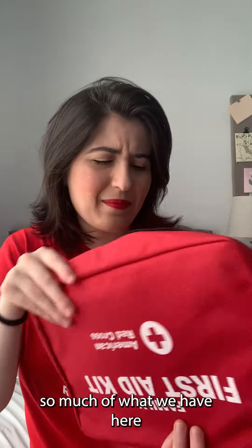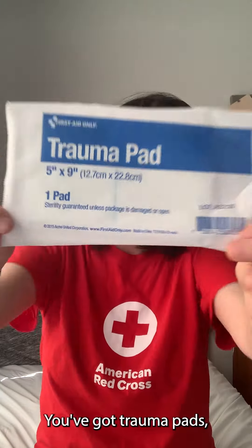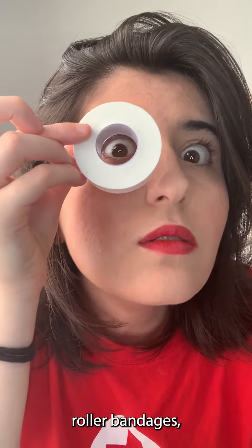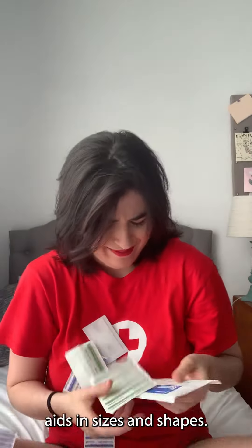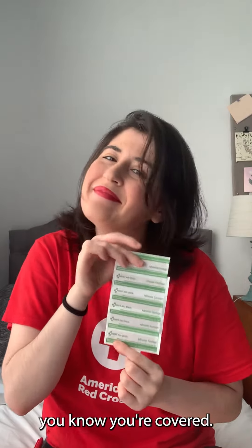So much of what we have in here is meant to help stop the bleeding if you get hurt. You've got trauma pads, sterile gauze, roller bandages, adhesive cloth, and of course a ton of different band-aids in different sizes and shapes. That way, whether you're bleeding in Barcelona or wounded in West Palm Beach, you know you're covered.